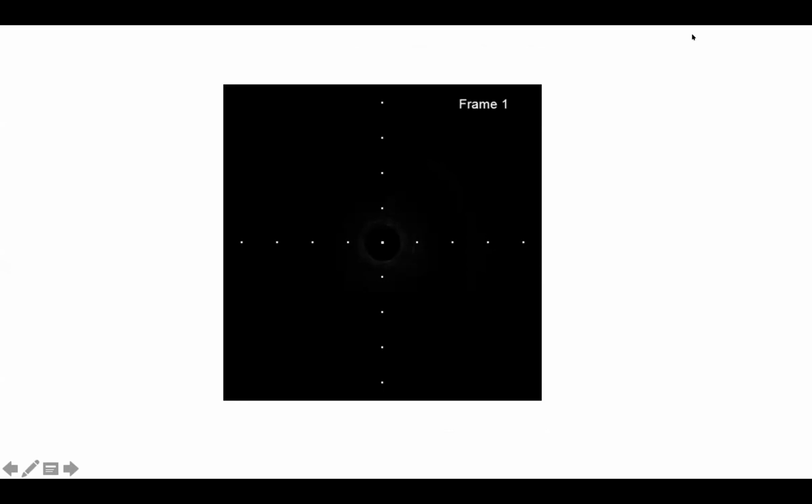And your question is in one way, is that an unstable plaque in the left main body? My personal feeling is that yes, you can get enough clearance of the contrast and the blood in the left main body to get an exact idea that there is a plaque and an unstable plaque and possibly a thrombus there, which will give you much more reassurance rather than just seeing a stenosis in the left main.